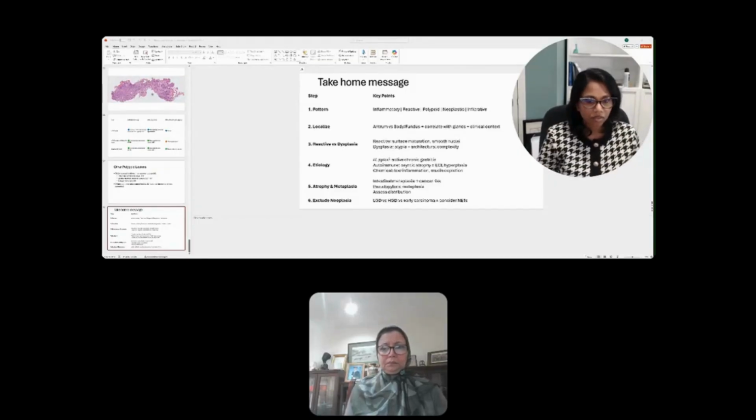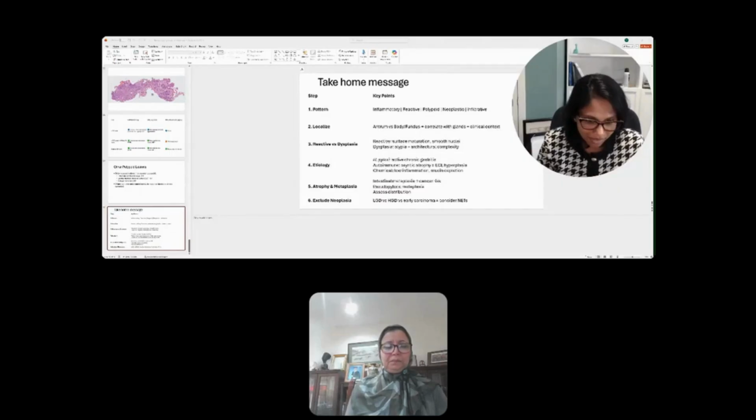So you have access to everything for the patient within the pathology reporting platform. The only challenge is if the endoscopic report hasn't been completed, or it's an incomplete report, I may not immediately have access to it, but effectively for all biopsies, the images are available to you.